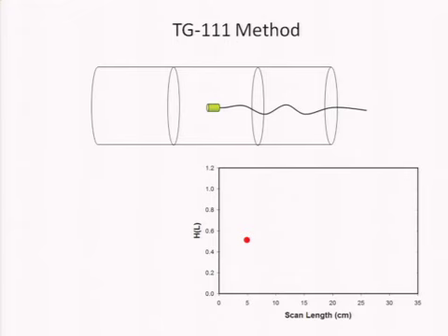And then, if you've driven CT scanners, on a GE scanner you have I's and S's, and you'd have to have a spreadsheet to do this because it's easy to get confused when the tech's breathing down your neck. But anyway, if you're able to do that, then you want the scan to be centered on the probe. You make that next measurement, and so on. And after some number of measurements, you actually then paint out this rise to equilibrium curve.